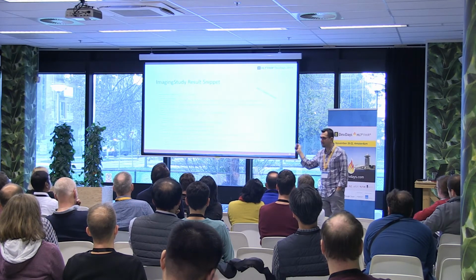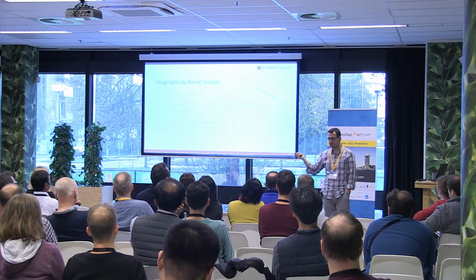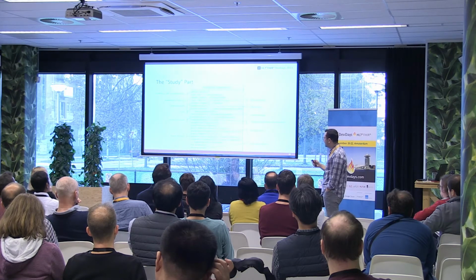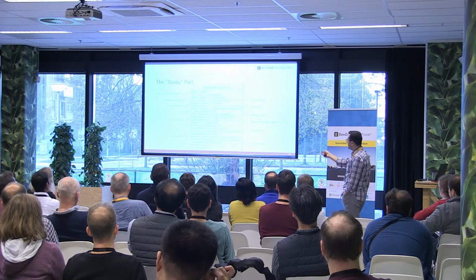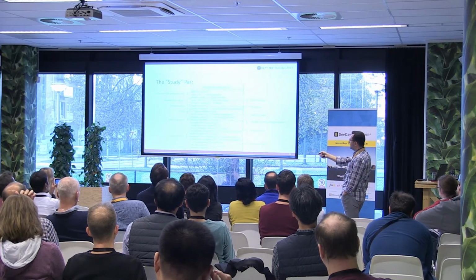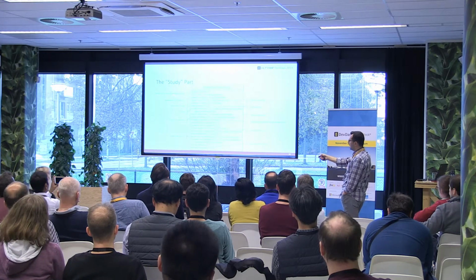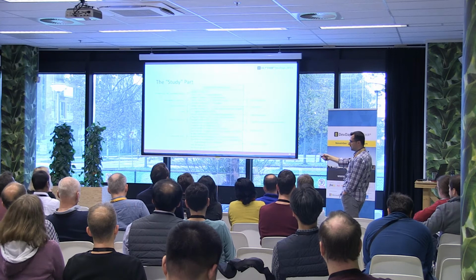For the record, this example is actually available on the HL7 FHIR website. They have an example right there handy. That's where it comes from. So if we dissect some of this information, in the identifier, you will usually have the DICOM study UID, and you probably will also find the accession number.